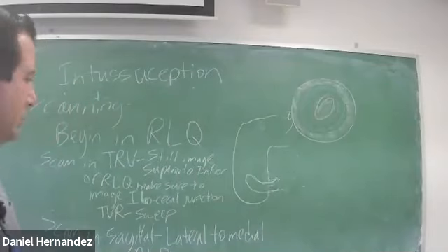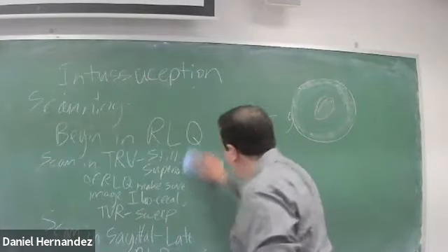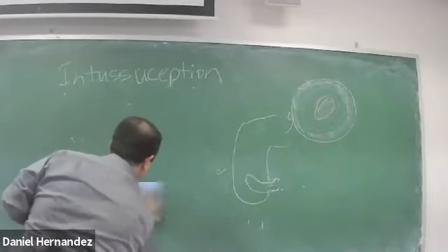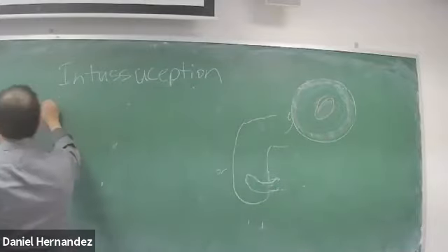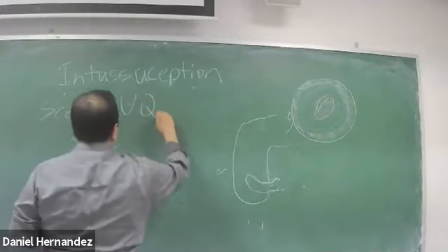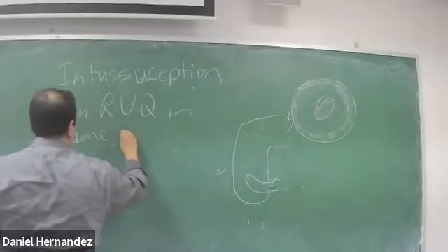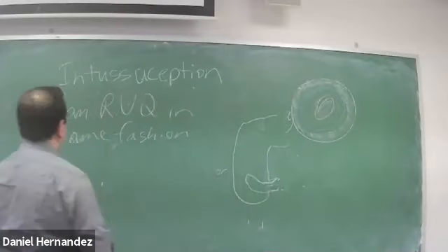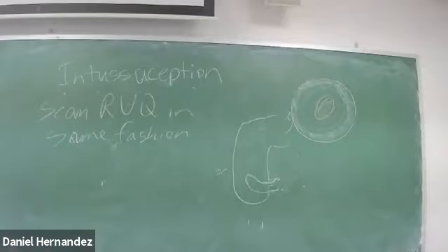So after I finish right lower quadrant, you then proceed to right upper quadrant. Scan the right upper quadrant in the same fashion.